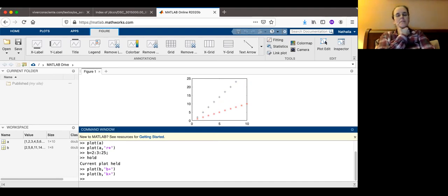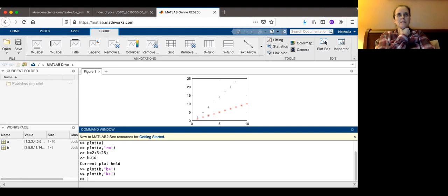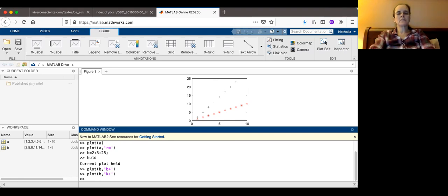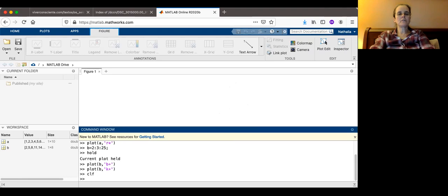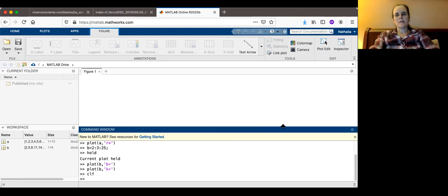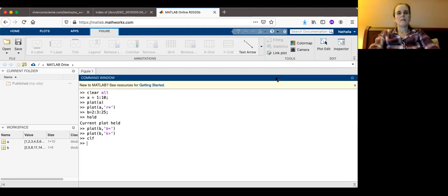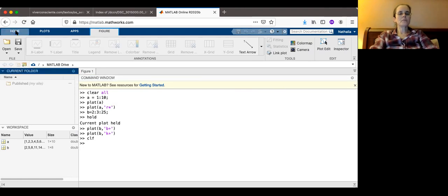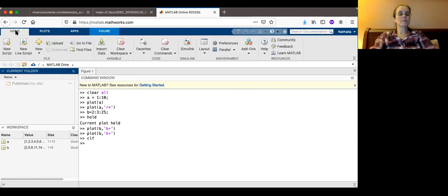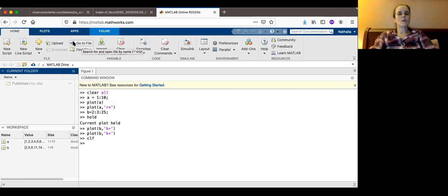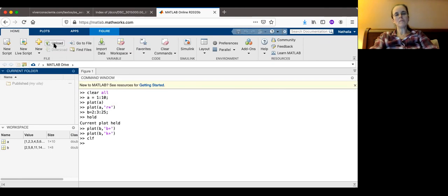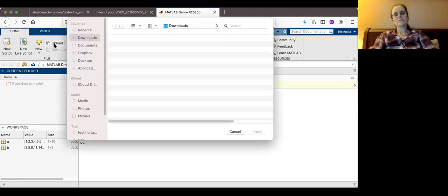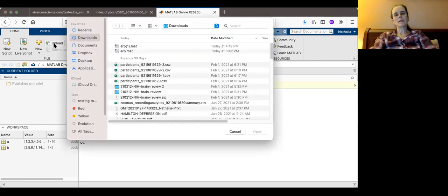Except instead of stars and pluses, you're going to see EEG data. So if I want to clear this, I can type clear figure. But now I want to upload the file that I downloaded to my computer. So I can go here on upload.